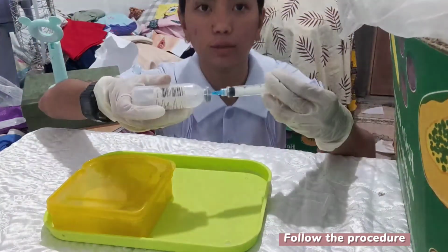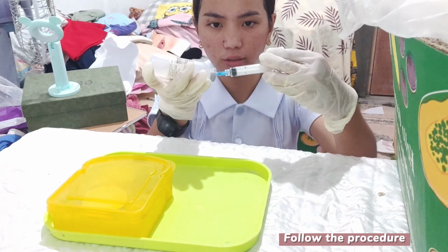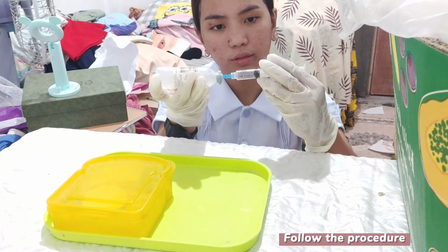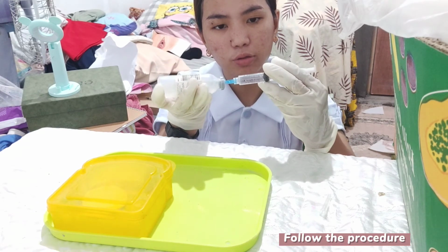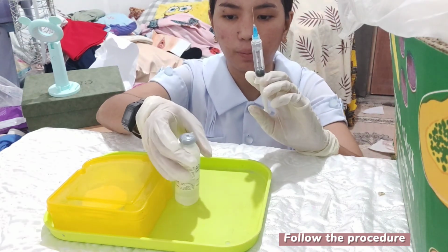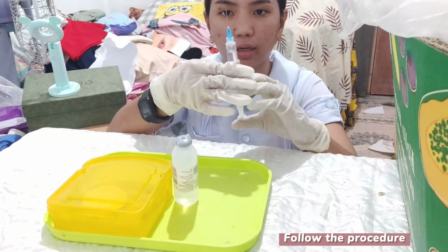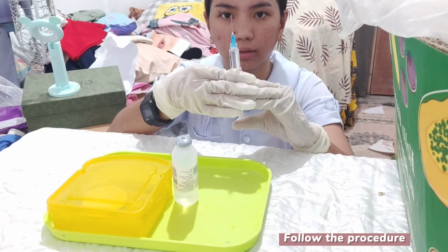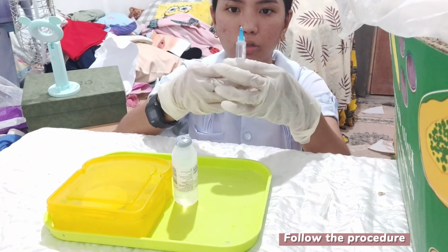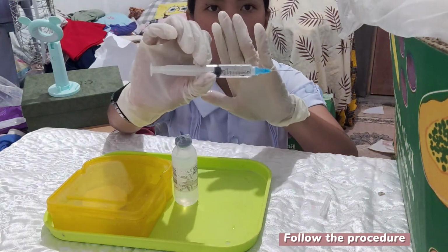So at eye level, we will aspirate the exact amount. After getting the exact amount, we will withdraw the needle. If there is a bubble, just tap like this and then release the air. So this is the exact prescribed amount of the medication.